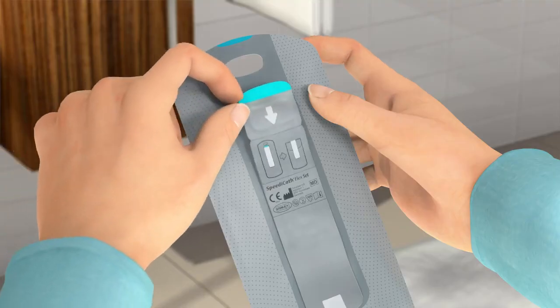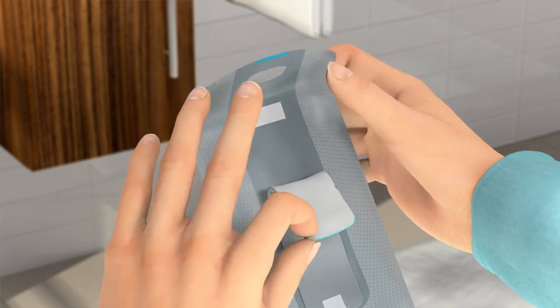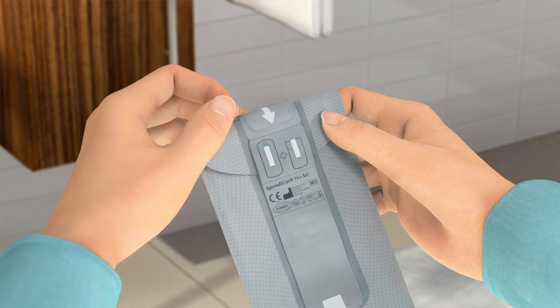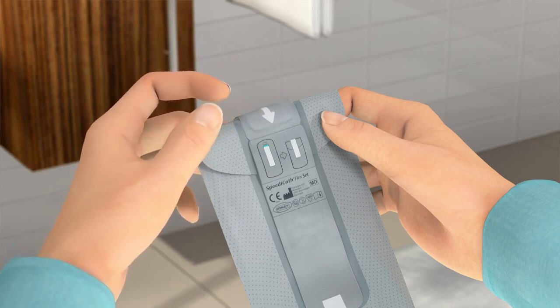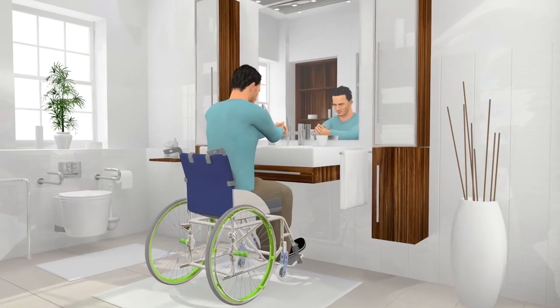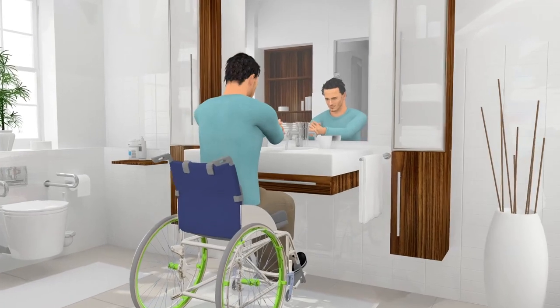Then put the catheter back into the packaging and close it by folding the flaps and sealing with the sticker on the back side. You can dispose of the catheter and the packaging in your household rubbish. Do not flush it down the toilet. Wash your hands and you have completed the process.